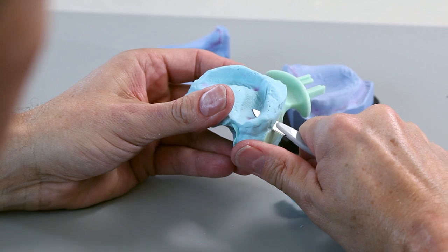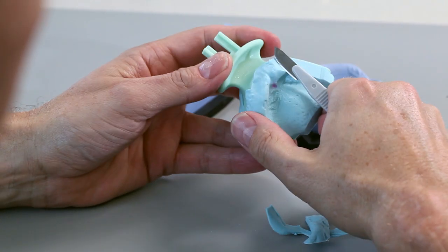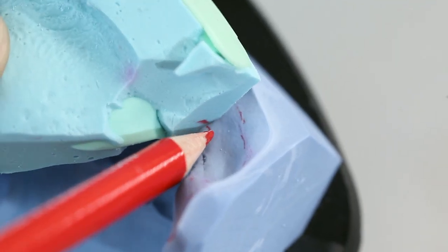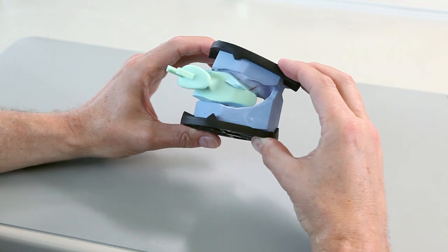Cut back the preliminary impression to ensure stable 3-point support of the models. Mark the position of the centric tray on the model to support the reproduction of the close-fitting 3-point support.